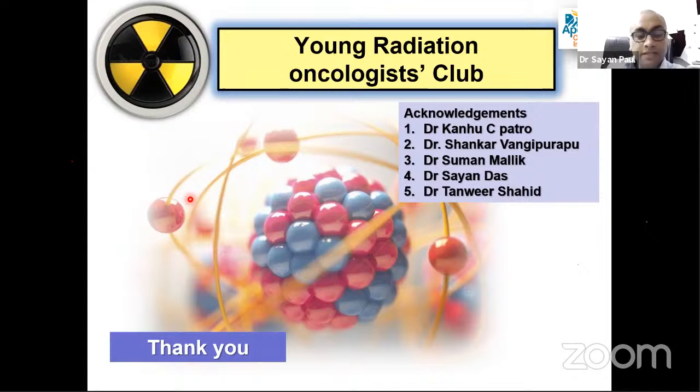I don't know if there is any standard protocol for adaptive radiotherapy. There are many published papers, and we did one thesis in our center, where around 20% difference in the volume led us to do a repeat planning or adaptive planning. That was a thesis protocol of one of our students. Okay.